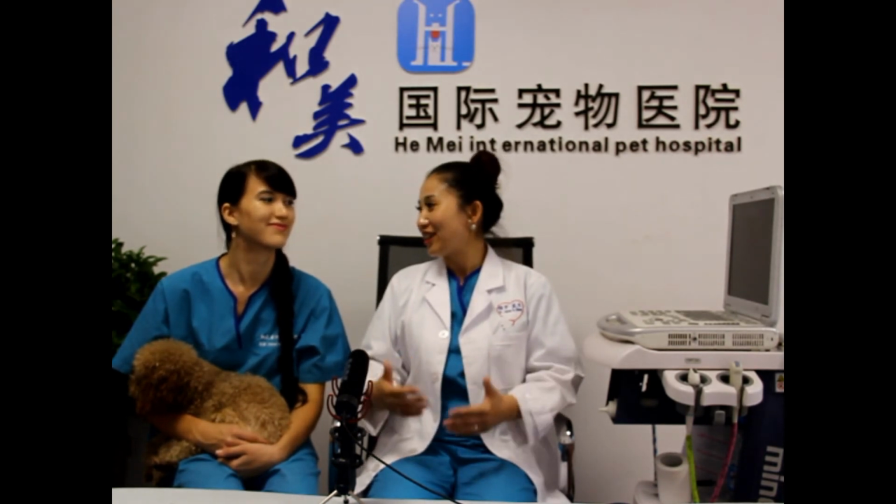So they referred the dog to me, and I did an ultrasound. I found the adrenal gland was very big, so we did surgery, cut it, and sent it to the lab, and found it was cancer. The adrenal gland was getting bigger and producing a lot of hormone, which caused the dog to show estrous behavior, and the dog even accepted the male dog. So I think it is very important that we can use ultrasound to help diagnose and make the correct treatment plan for the dog.